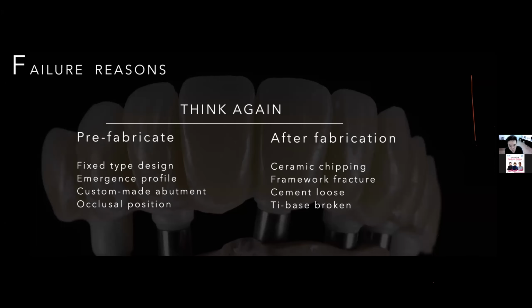You can support this problem. So this should never happen in the patient's mouth or at the dentist, because a ti-base breaking is 100% from the technician's job.